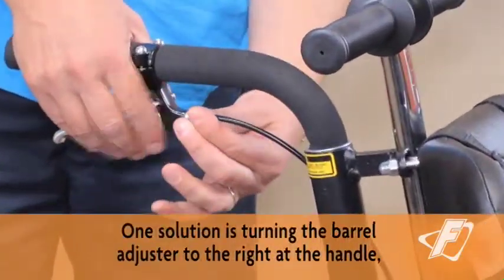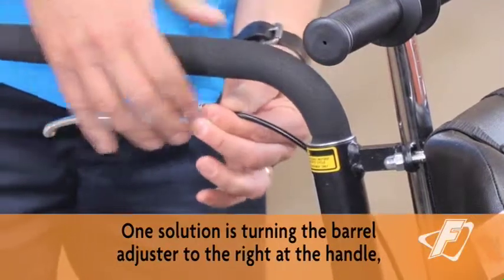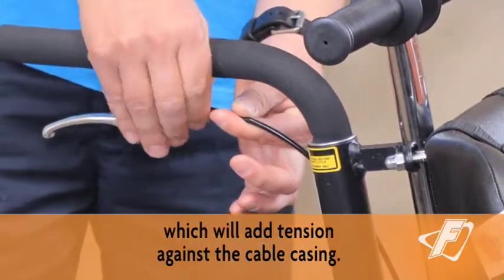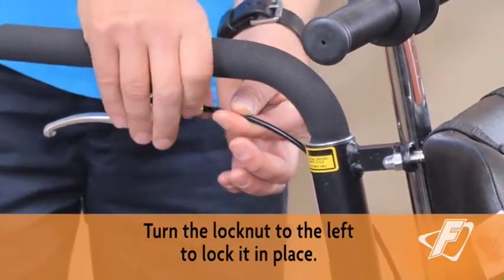One solution is turning the barrel adjuster to the right at the handle, which will add tension against the cable casing. Turn the lock nut to the left to lock it in place.